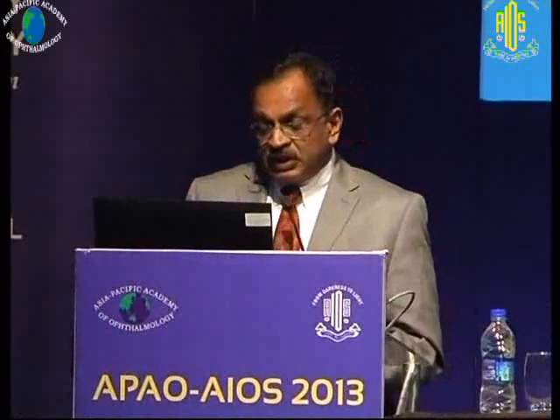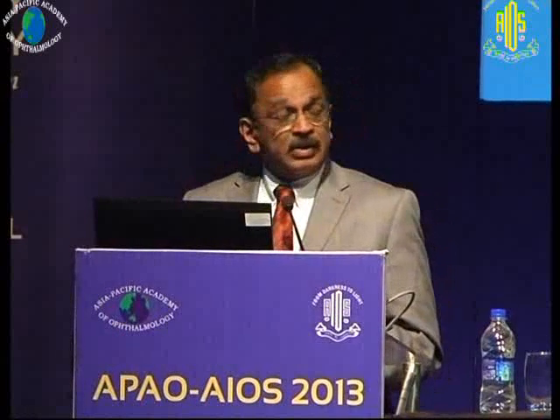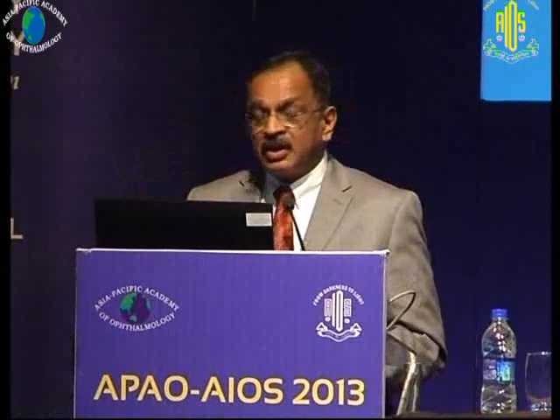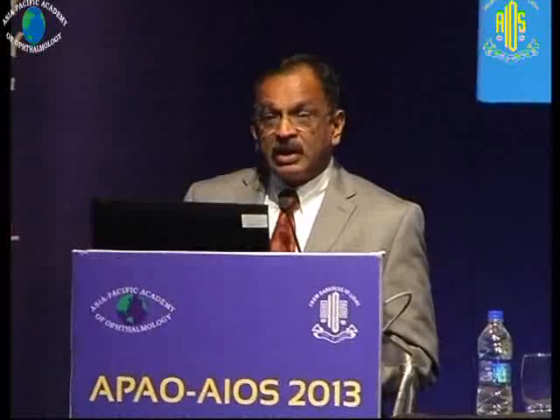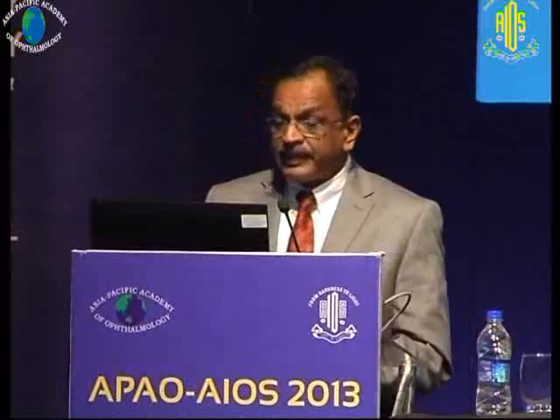Subretinal cysts, you don't see this very often. This is a case where you make a retinotomy closer. I had to use a forceps in this, but usually when you make a small retinotomy, the cyst tends to ooze out through that, squeezes itself and comes out very easily.